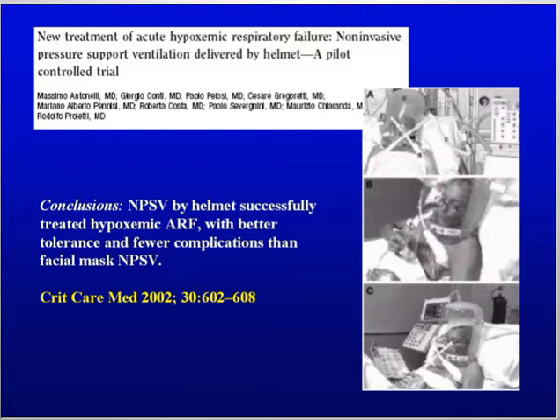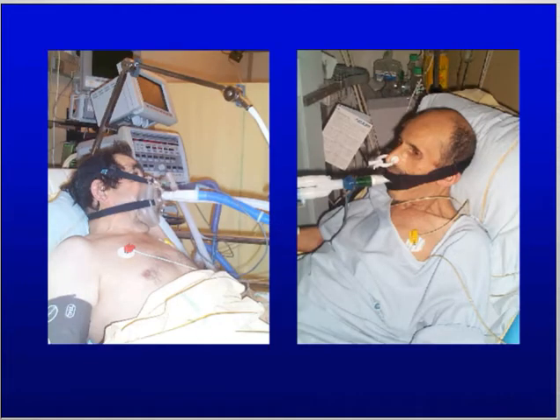And we'll see in the future whether the improvement of tolerance will balance the negative effects on the quality of ventilation, and what is the most important for the success of NIV. Therefore, I think that in the ICU, if you use non-invasive ventilation, it may be important to be able to vary the type of interface. For instance, in our ICU, we use this classical face mask.